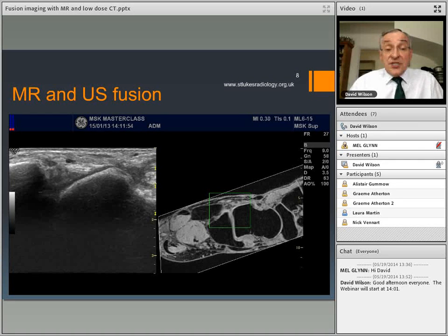One use of this is simply educating yourself as to how the anatomy of the ultrasound relates to the underlying structures, because I don't think I'd really realize that the two joint surfaces, this is the tibio-fibular joint here, and here the tibio-talar joint, how they run away at different directions, just looking at the ultrasound. Of course, it becomes obvious using the MR.